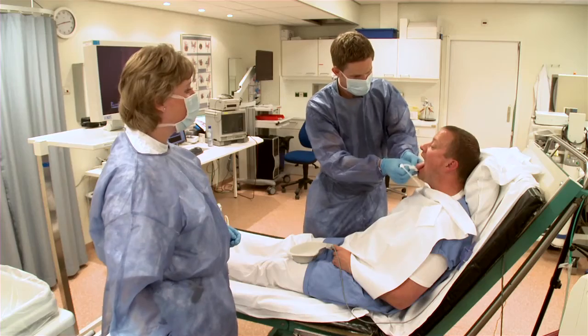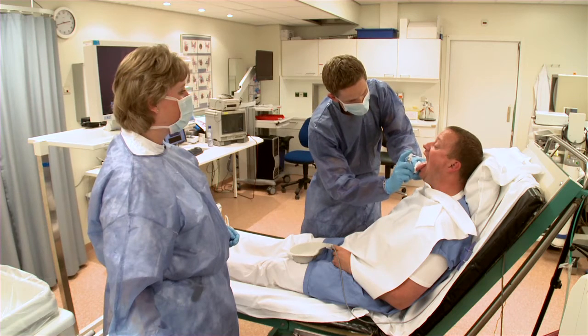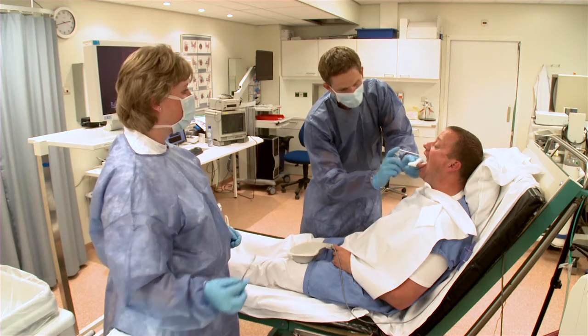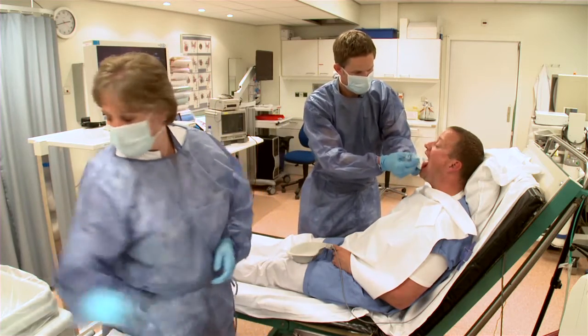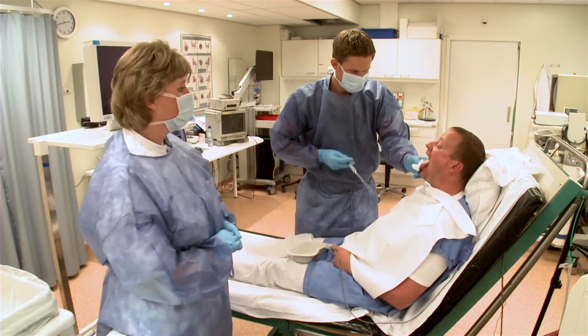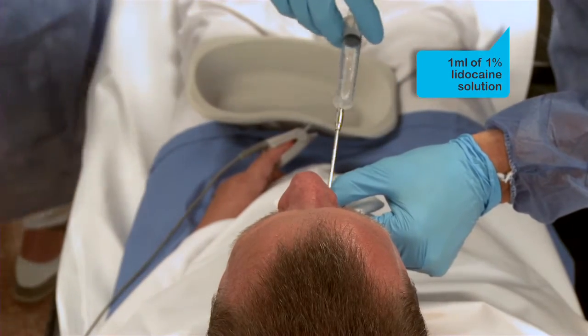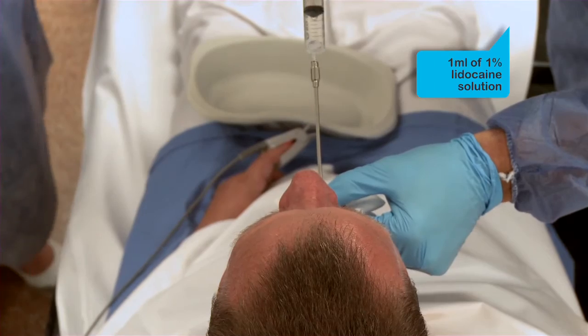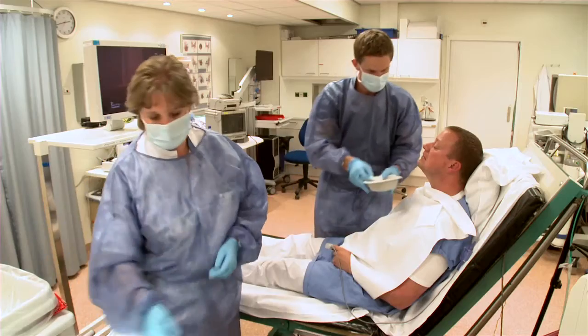Then the nurse calls the doctor, who checks to what extent the patient is anesthetized. This is done by applying one or two sprays of 10% lidocaine to the posterior pharyngeal wall. Finally, a syringe is used to apply one milliliter of 1% lidocaine solution to the vocal cords. The patient is now adequately anesthetized and ready for their bronchoscopy.